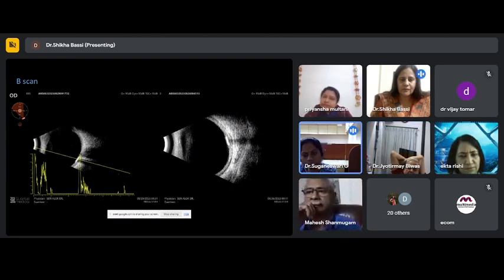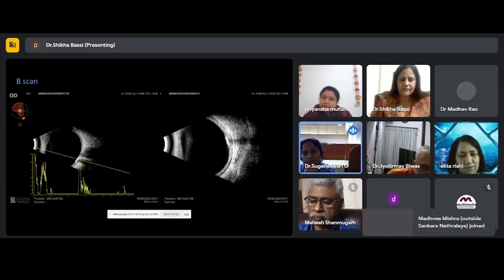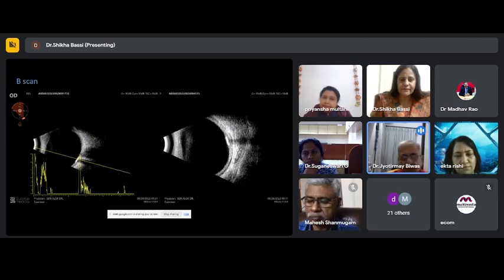So, JB sir, what is your line of thinking in terms of what this condition could be? Choroidal osteoma, that is agreed upon. Now, what was the inflammatory condition? What is the diagnosis of this patient? Hyperfluorescence is there. It's definitely inflammatory. It didn't look like VKH, it didn't look like posterior scleritis. So, what would you name this? Because FFA is not very typical of either of these entities, I'm keeping it as a mixed diagnosis or undiagnosed condition. I'll treat it as an inflammatory disorder. I am very convinced with the disc hyperfluorescence and choroidal thickening. I'm quite convinced that this is an inflammatory lesion. I will stop at that level.